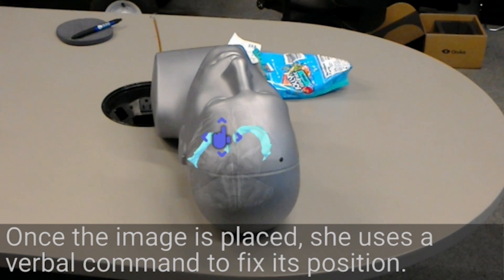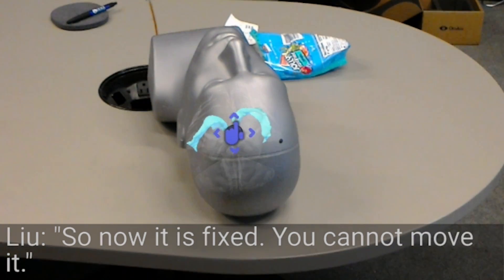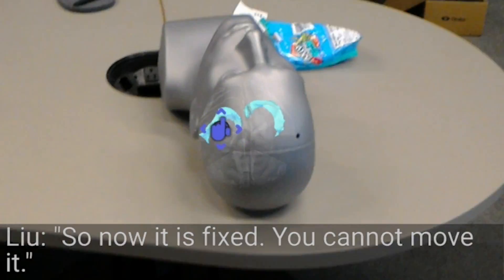Fix anchor. So now it's fixed — you cannot move it.